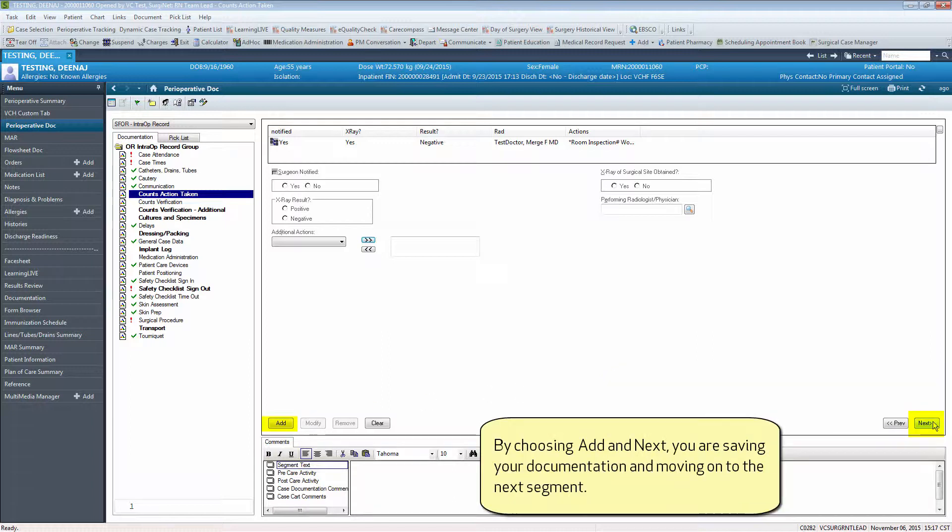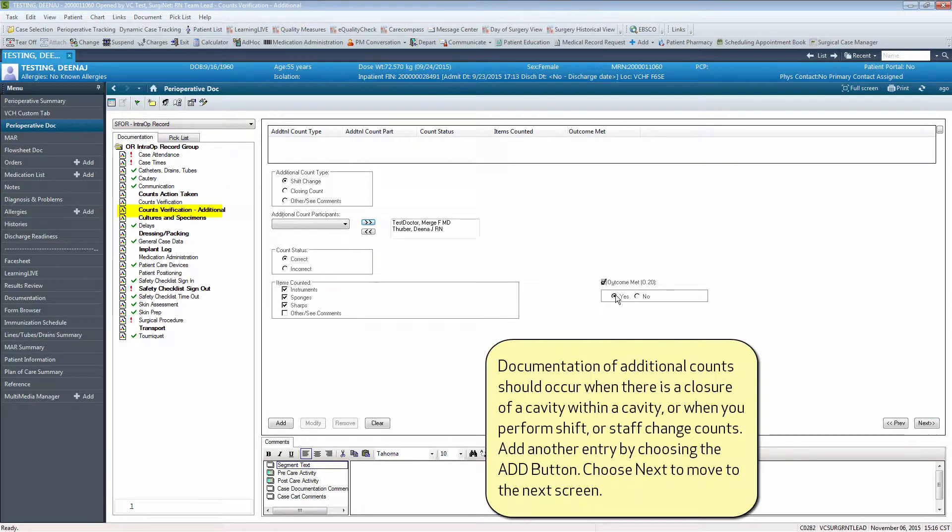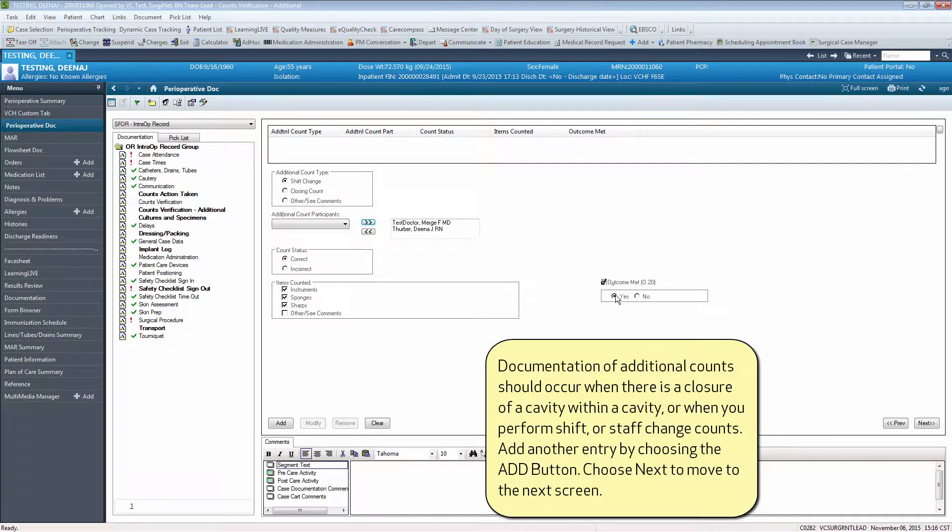By choosing next, you are saving your documentation and moving to the next segment. Documentation of additional counts should occur when there is a closure of a cavity within a cavity or when you perform shift or staff change counts.